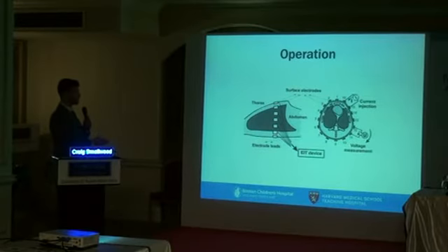And essentially what the device does is it'll take a pair of electrodes. So right here we're injecting some electricity, a really tiny amount. You can't notice it. The patient will never feel it. But we inject a tiny amount of electricity into the subject and then measure really quickly all the voltage measurements around the whole chest. So that would be one set of images. And then you rotate this to the next, so then we'll inject at 15 and 14 and then measure all around the chest. And you take thousands of images every single second.